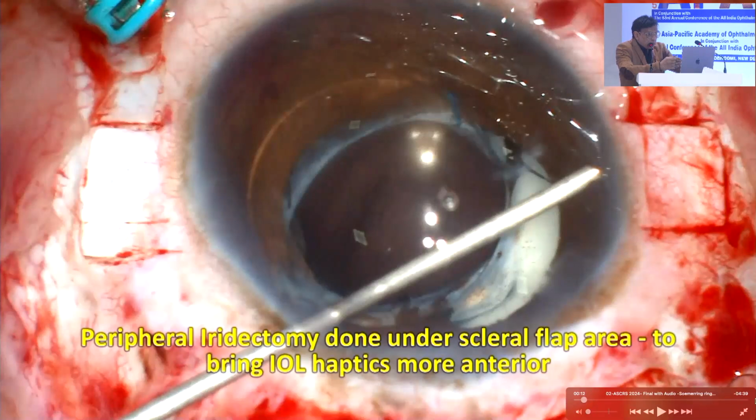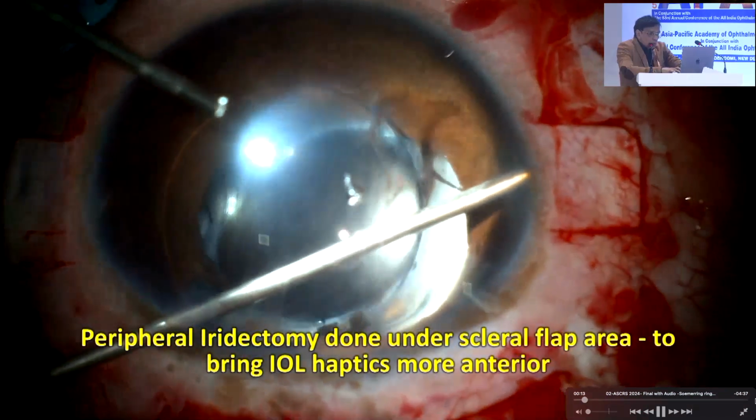But that can happen only if you have a support behind. Yeah, that's right. So Rohit, anything you can add? Soemmering rings are the basic culprit in this, so those have to be managed. If you manage them, then the centering would be easier.